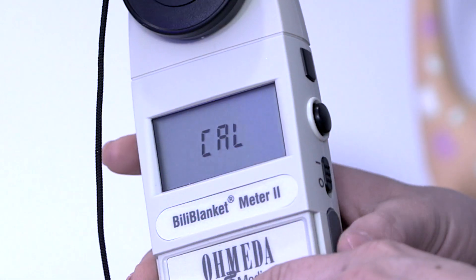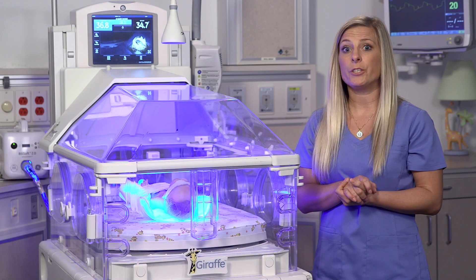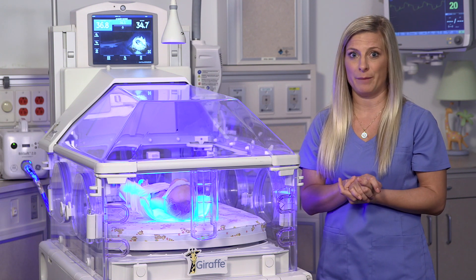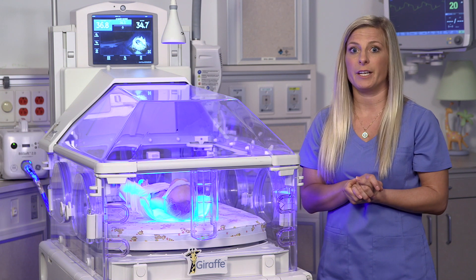When zero adjustment is complete, the CAL message will disappear. Just remember, when you're doing this, make sure to keep the meter still. Do not subject the BillyBlanket meter 2 to shocks or vibration, especially at the time of zero level adjustment. Inaccurate readings may result.